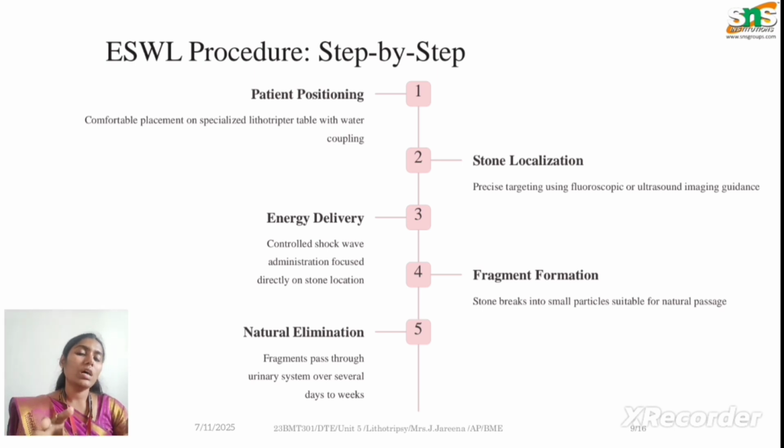Then through this, we will send water, your focused energy. Through the water coupling method, we will make it hit the kidney stones. Once it passes through and interacts with the kidney stones, everything will get fragmented, shattered into so many small pieces, which are very easy for natural passage through the urine. After that, natural elimination happens.